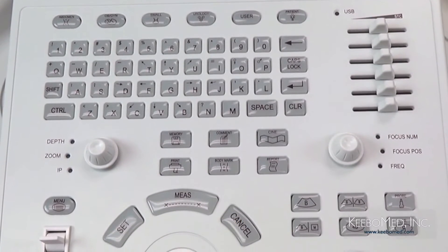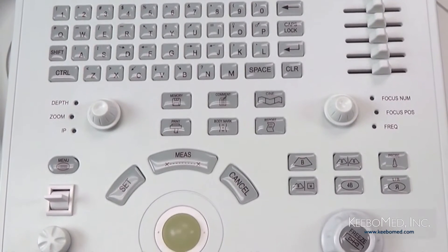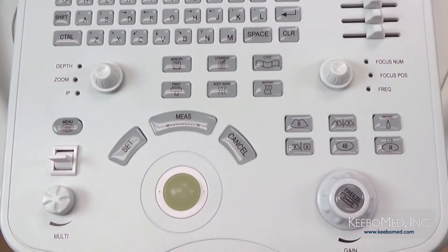Here is an overall look at the keyboard. More specifics of functions and features are covered in a later video.